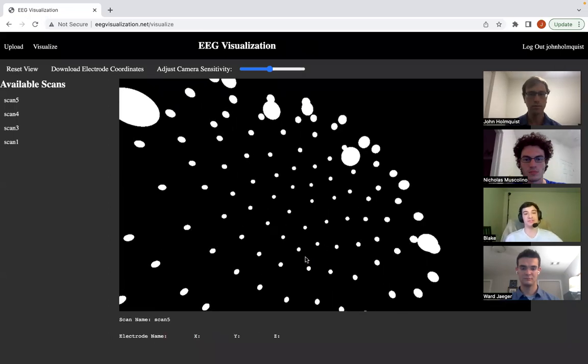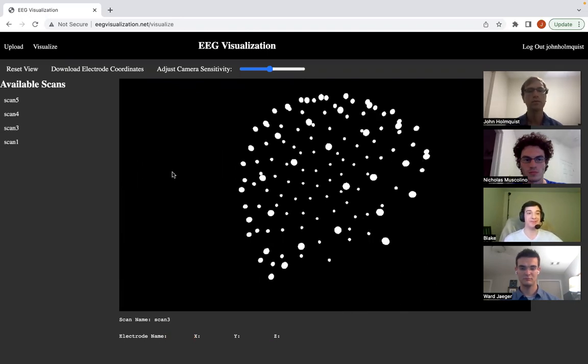One of the challenges that I ran into making this visualization was the renderer window size. I had to account for that when doing the ray casting and normalizing the coordinates for that. It took me a while to figure out what the issues were going on there, because the ray cast all seemed a little bit shifted, but once I figured that out, it was smooth sailing from there.